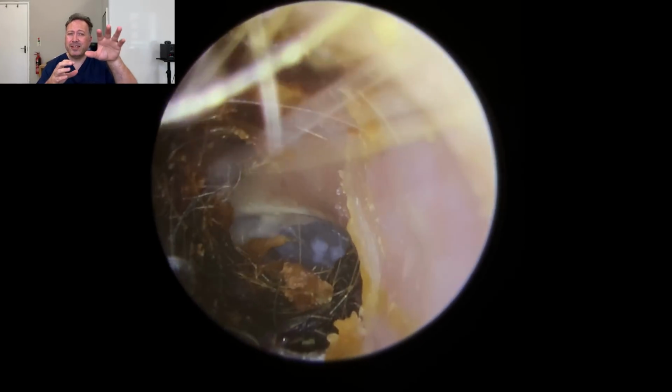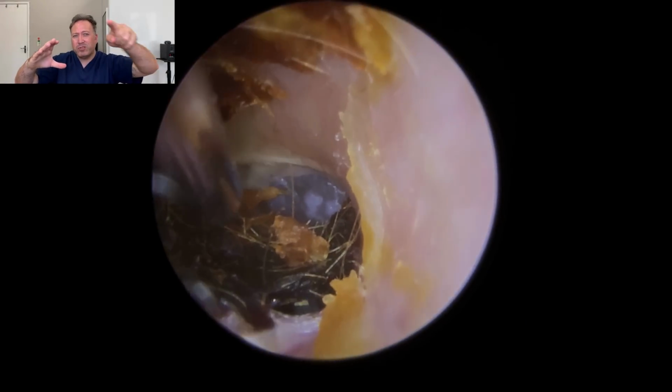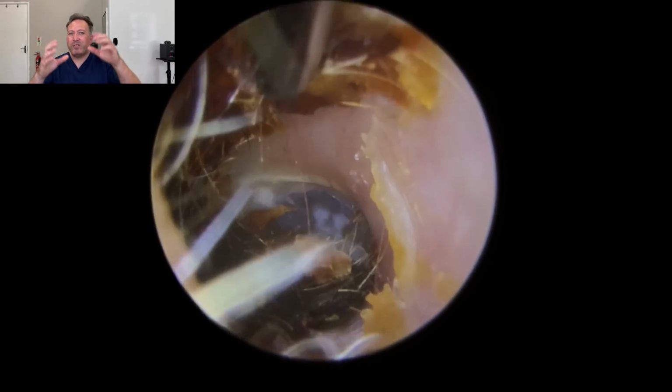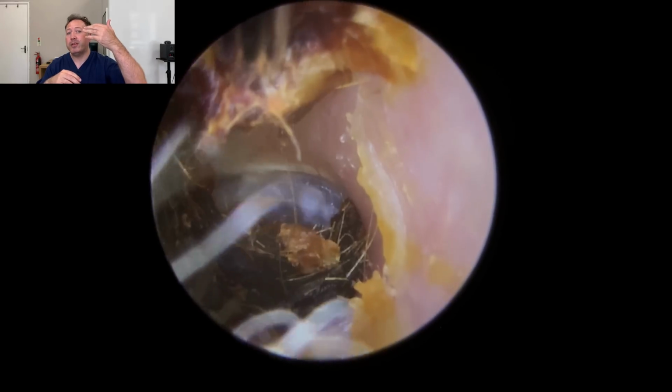What you can see here, this is the second ear, but look how the wax is looped. It's kind of spiraled down the canal. This is the twisting action, you see, of the Q-tip going in here. It's actually spread it and twisted it around. So it's very dry. So I'm going to concentrate on this top section because this is the closest to the outer part of the ear canal.